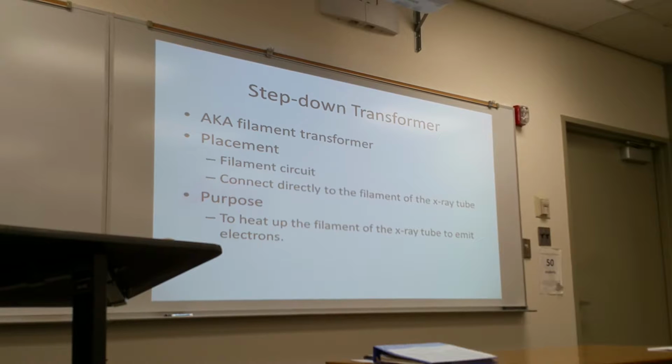And they connect directly to the filament of the X-ray tube to help generate thermionic emission.